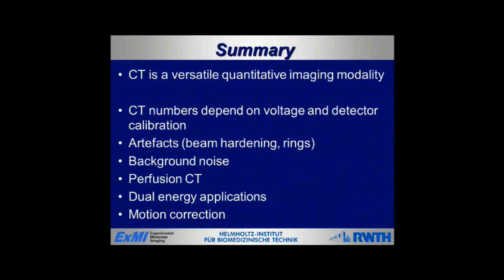Nevertheless, you can perform perfusion CT. You have the option of doing very interesting dual energy applications and very nice ways to do motion correction or even to assess functional cardiac data.